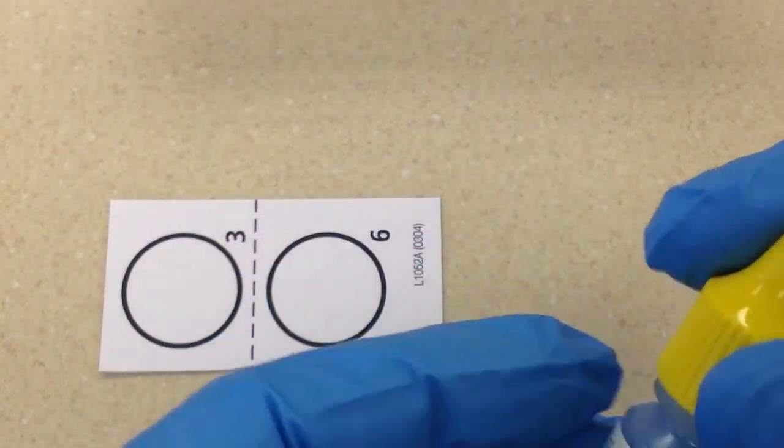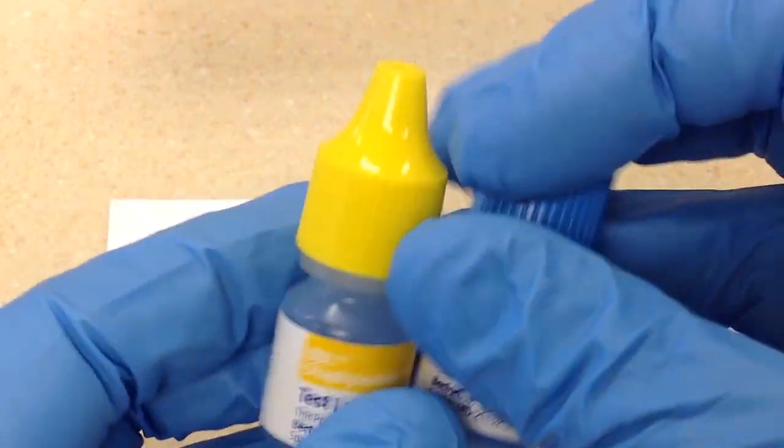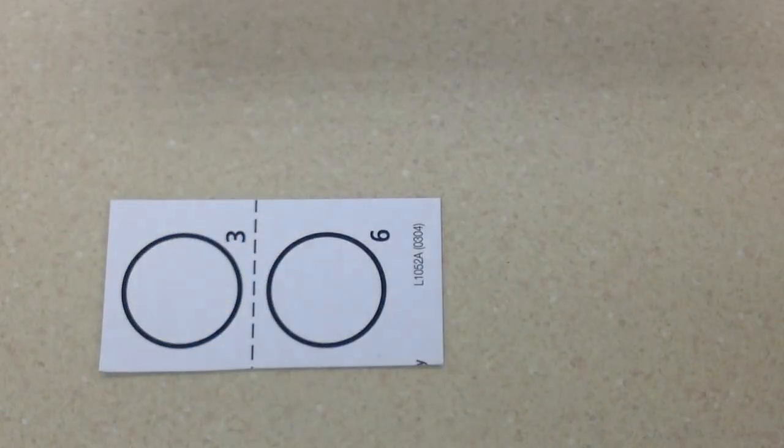On one circle we're going to have the test latex, and on the second circle we're going to have the control latex, which is just going to make sure that we're not getting any false positives.